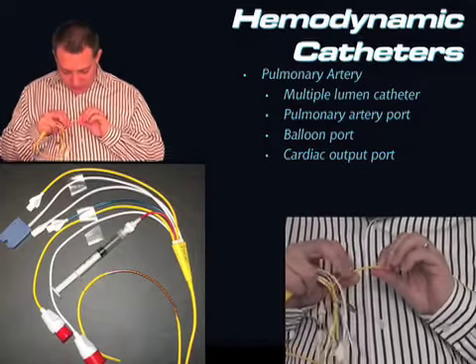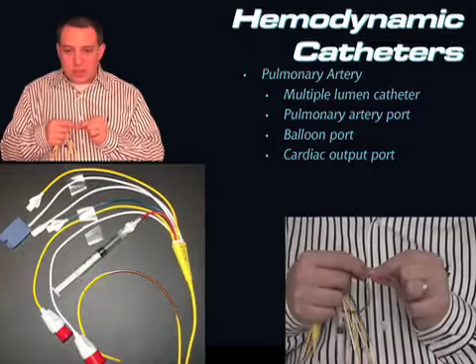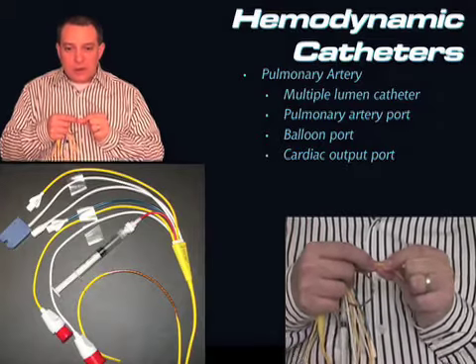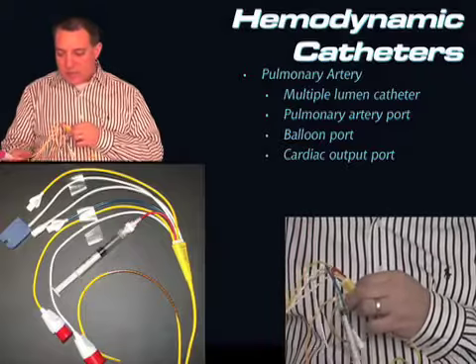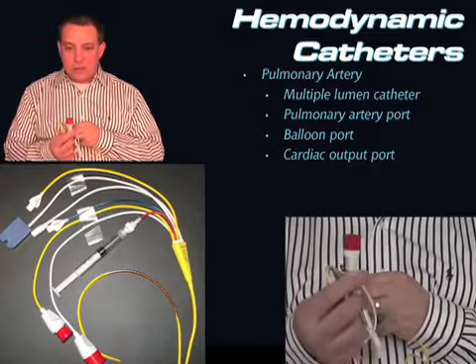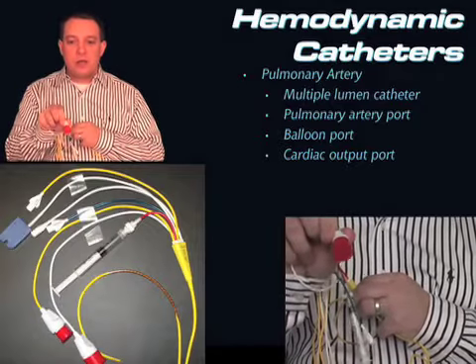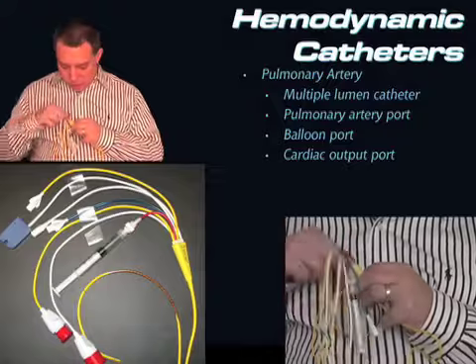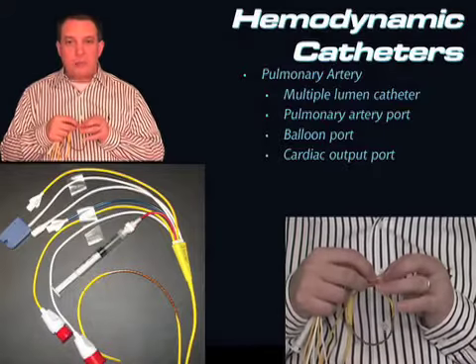It's really hard to see, and I'm sure you're not going to see it on the video, but there's actually this little tiny dark spot right here. This little dark spot actually runs the length of the swan, and it dumps out right here at this cord. This cord is designed to plug into something called a vigilance monitor, and all this cord does is provide temperature. So all this right here is a thermometer probe.